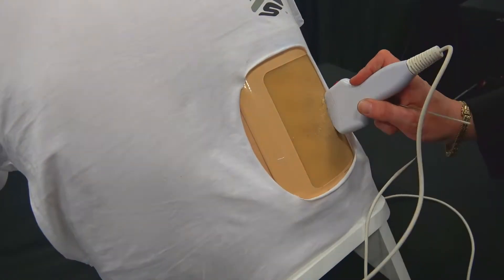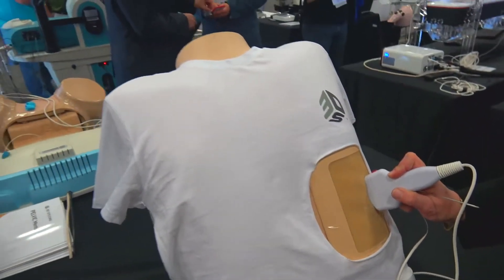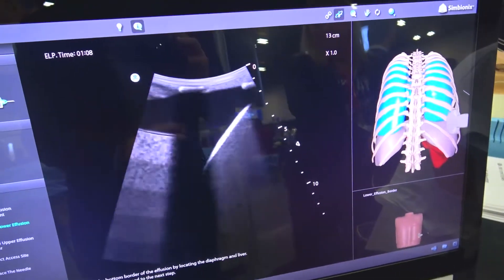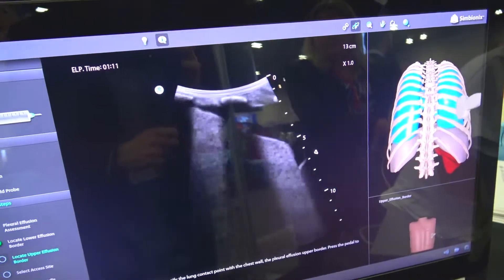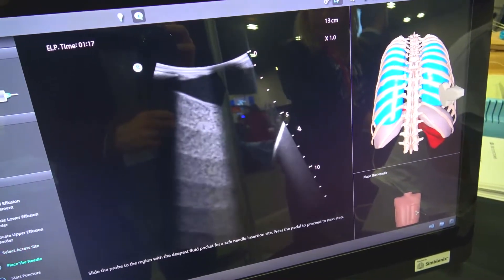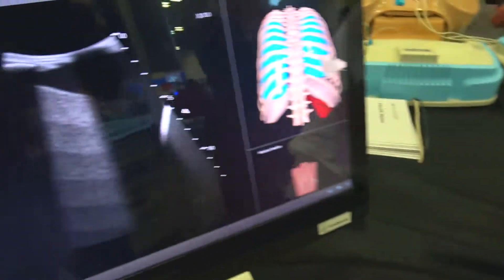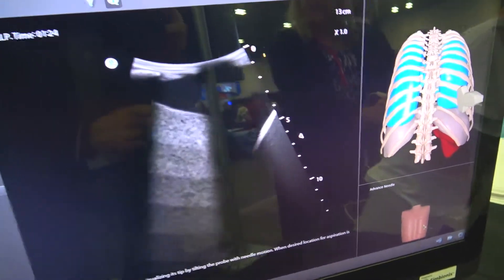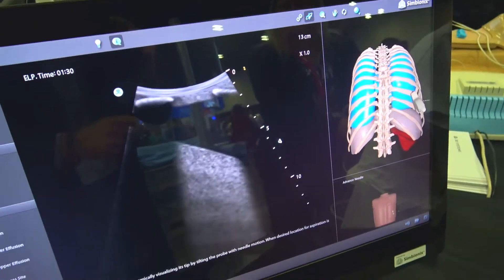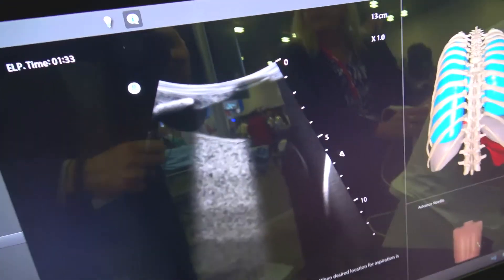Our next new product is interventional ultrasound. We have our needle and our probe and we're in a step-by-step case that's basically asking me to find the pleural effusion assessment, and I step on the pedal and it lights up green for me there. Now I'm placing the needle and I'm going to start my puncture — you'll see the needle. There it is, that little dot. And now we can start our suction.